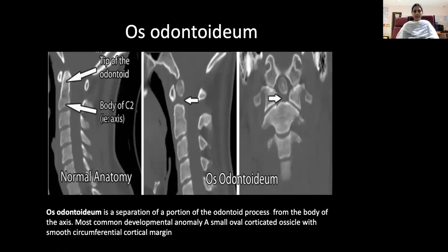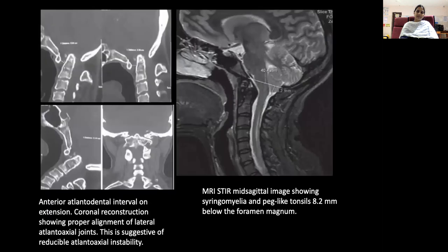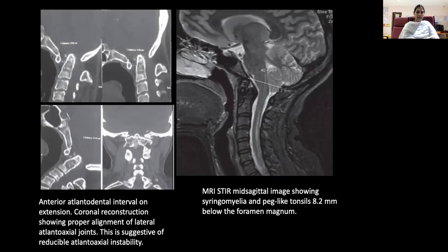Os odontoideum. This is the normal anatomy at the tip of the odontoid and the body of the axis. Os odontoideum is a separation of a portion of the odontoid process from the body of the axis — the most common developmental anomaly — presenting as a small oval corticated ossicle with smooth circumferential cortical margins. This is the anterior atlanto-dental interval on flexion, neutral, and extension positions, showing the distance is reduced. Coronal reconstruction shows proper alignment of lateral atlanto-axial joints, suggestive of reducible atlanto-axial instability.